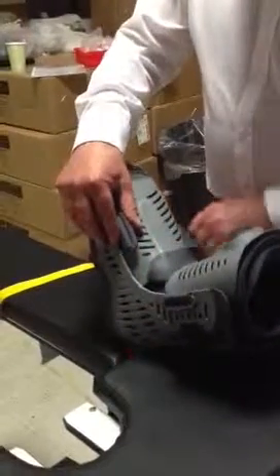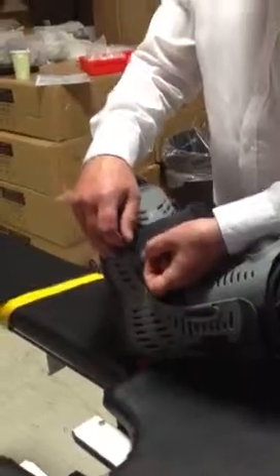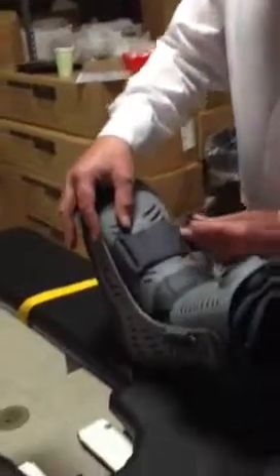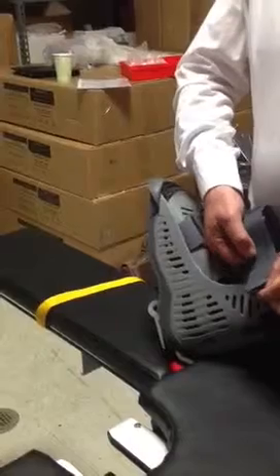So normally this is done whilst the patient is being induced with the anaesthetic. So at my brother's hospital, actually the anaesthetist puts the boot on. We use a calf pump on both legs during surgery.